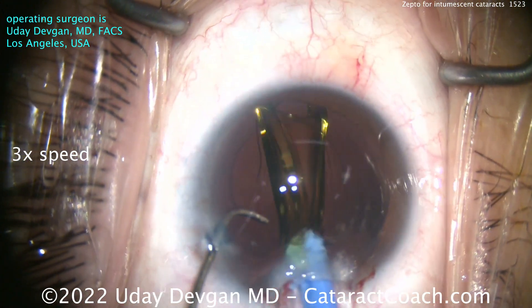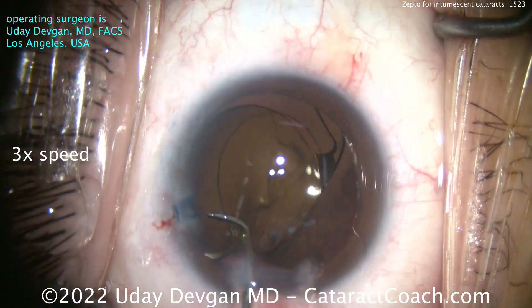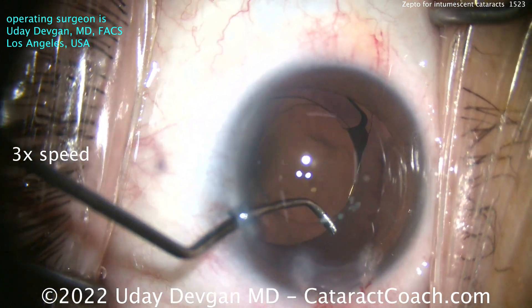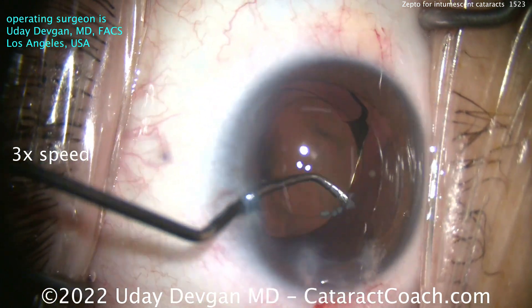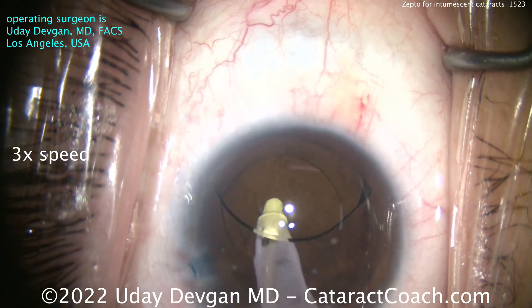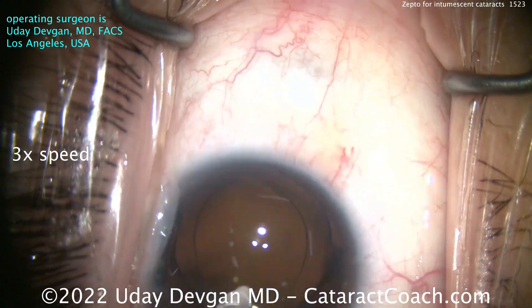Now let's deliver our lens. In this patient we're using a single-piece acrylic monofocal lens. It goes into the capsular bag very nicely. The lens has a 6-millimeter optic, and now let's center up that lens. There's a little bit of lens material still adherent to the capsule — we'll get that out at the end, making sure there's really nothing to cause any post-op inflammation.